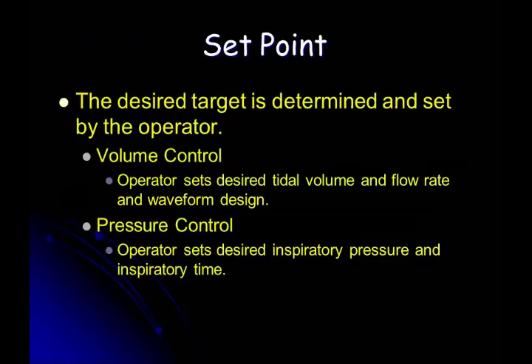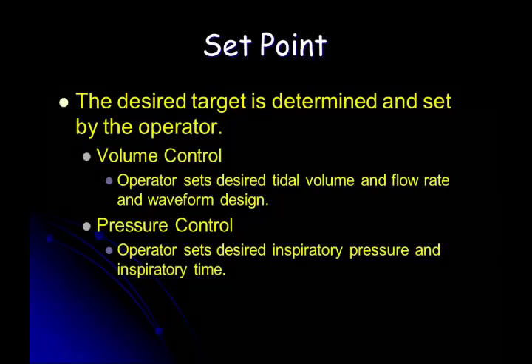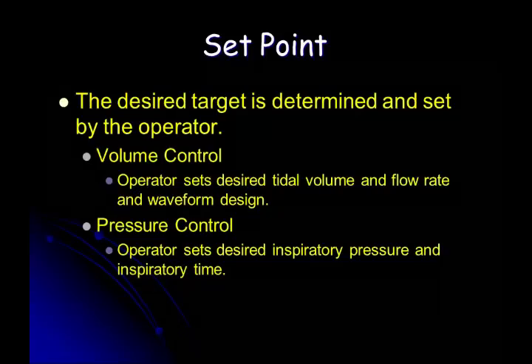Okay. So let's talk about set point first. With set point, there's a target that I want to have. And this is where the concept of volume orientation or pressure orientation comes into play. I can mechanically ventilate somebody where I'm controlling the volume that's delivered. Every time a breath is delivered, it's delivered at a fixed volume. In that case, as we know, pressure becomes the variable.